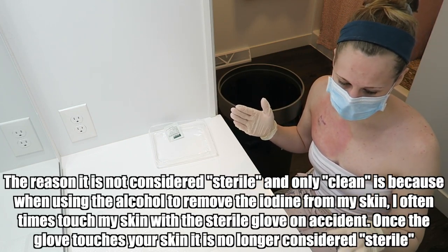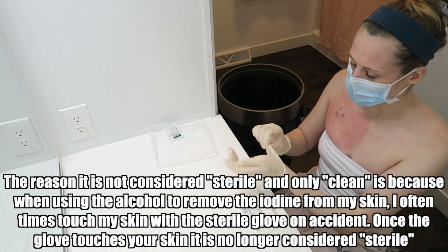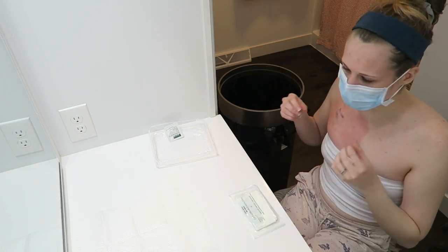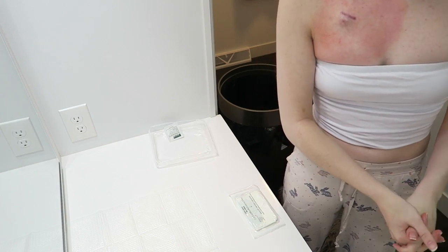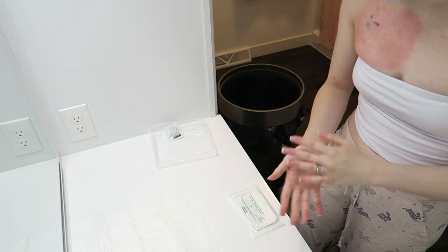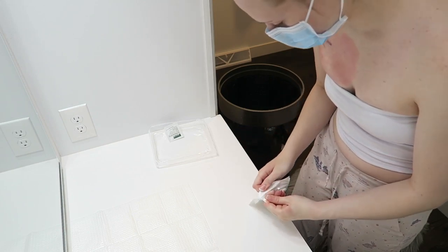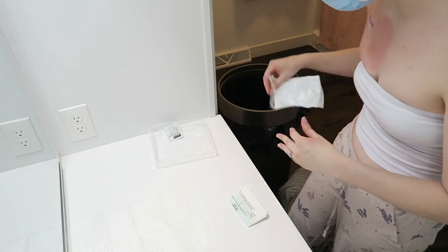However, I'm just gonna go ahead and change into a new pair of sterile gloves to do the rest of this procedure. I don't know why I'm calling it a procedure. So we're gonna go ahead and take those gloves off. Again, we're gonna wait until the alcohol on my skin is completely dry before starting the next step, which is why it's good I'm changing gloves, because this gives me some more time. So we're gonna go ahead and open the gloves. These gloves are a lot higher quality, as you will be able to tell.